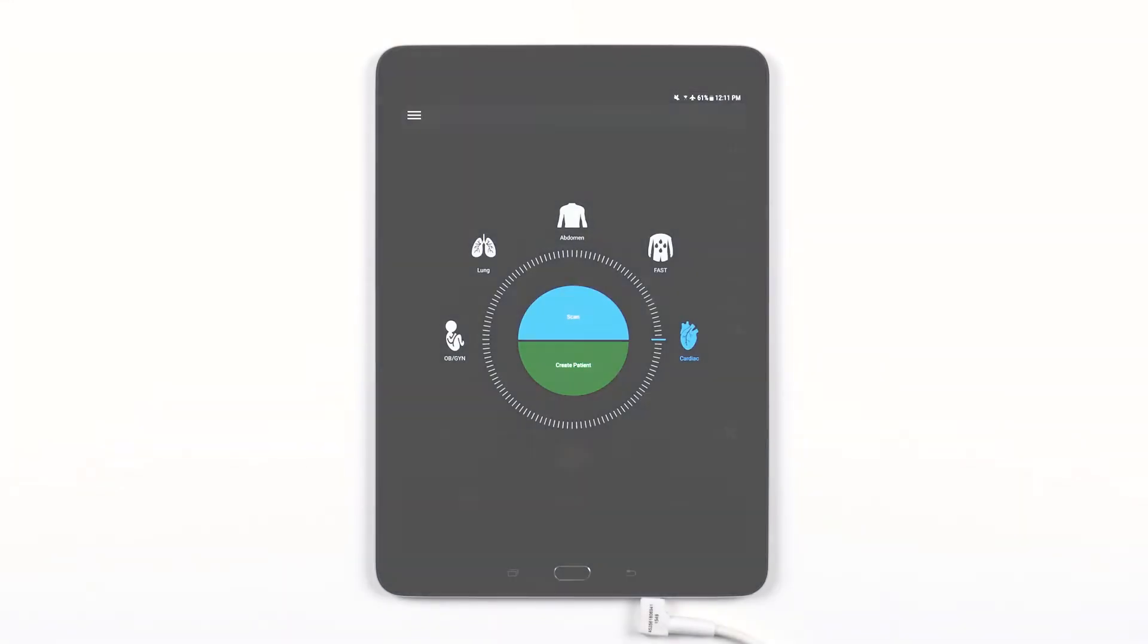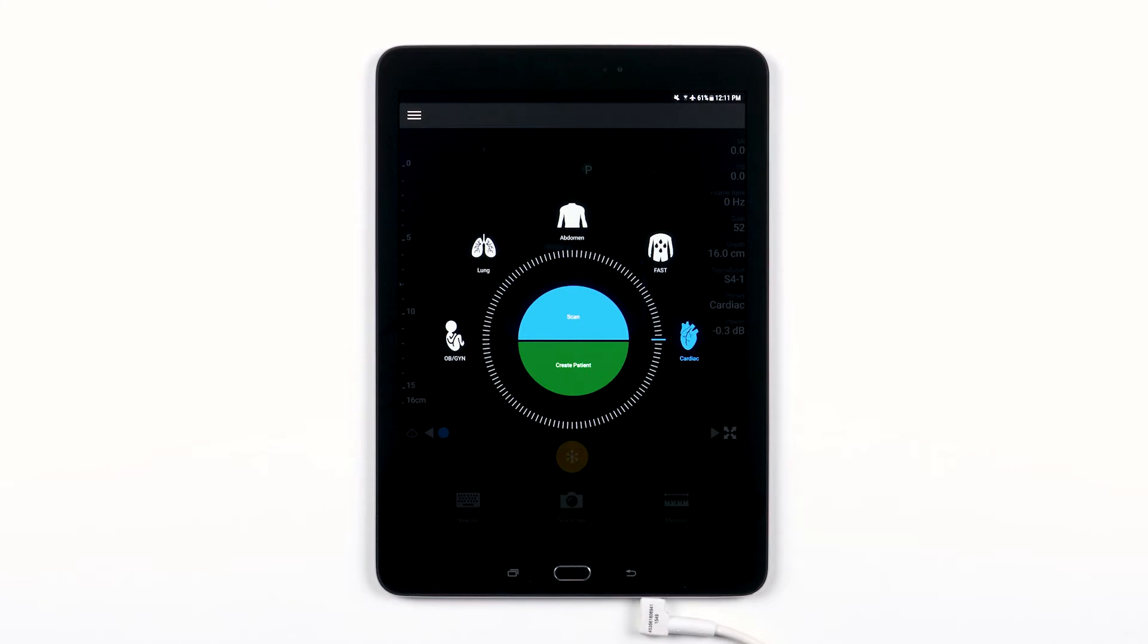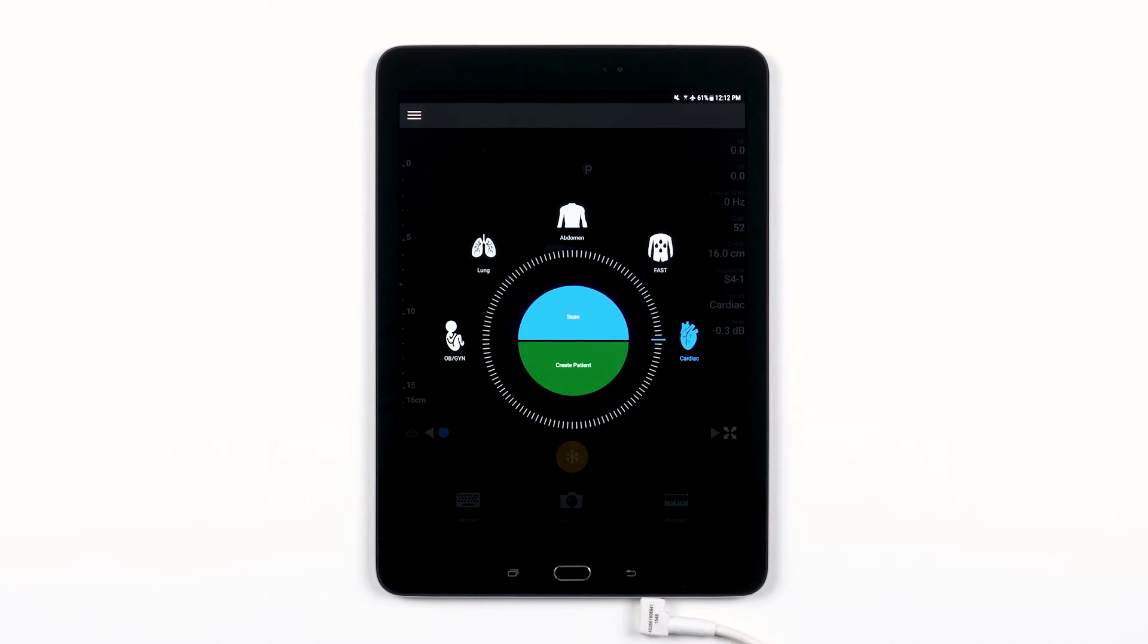In this video, we are going to go over setting up connectivity profiles on your Lumify Ultrasound System. Connectivity profiles let you define a set of storage destinations, export strategies, exam settings, and connection settings.